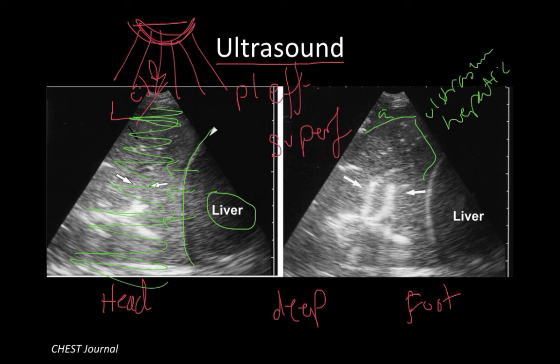Within the hepatized area, you can see brightly lit spots. On ultrasound — exactly opposite of a chest x-ray — air bronchograms appear bright. They show up as white spots and white lines because air is very echogenic relative to the surrounding tissue, which is filled with purulent material and fluid. An image like this is considered consistent with pneumonia, and treating the patient would be definitely appropriate.